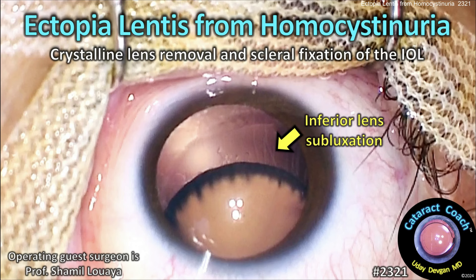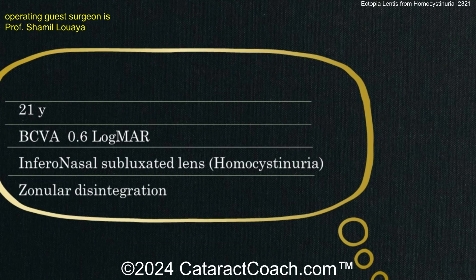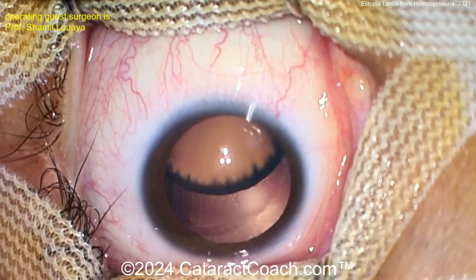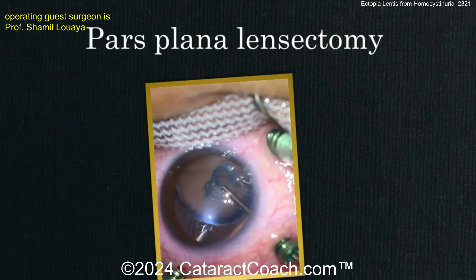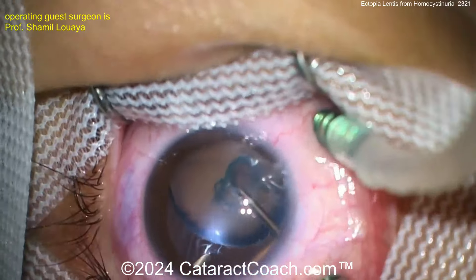This case covers ectopia lentis from homocystinuria, requiring crystalline lens removal and scleral fixation. This is a 21-year-old patient with poor best-corrected vision and an infranasal subluxed lens. Homocystinuria is a very unusual condition — you may never encounter one of these cases in your career.